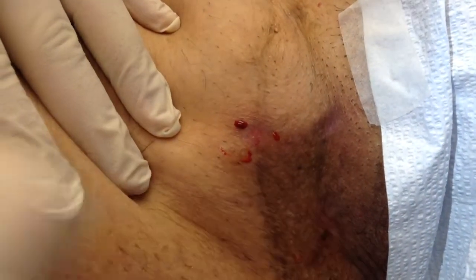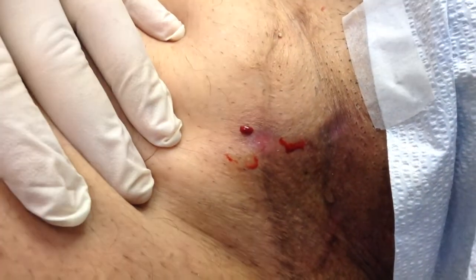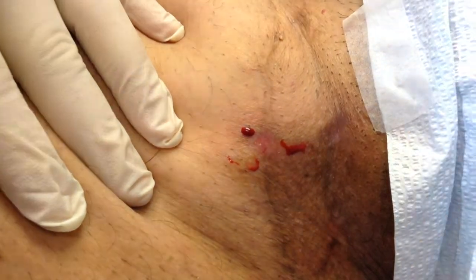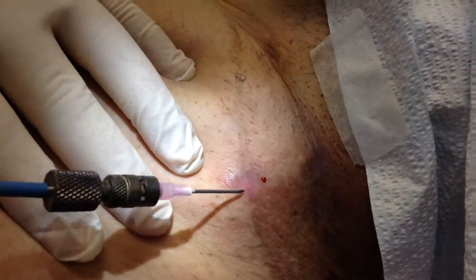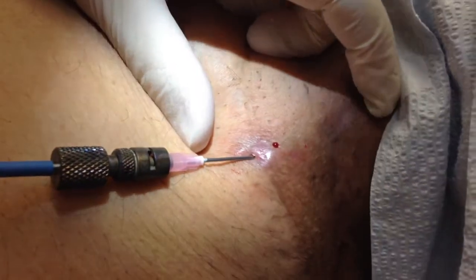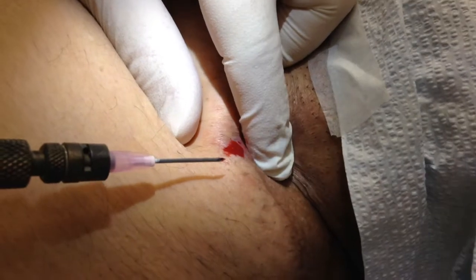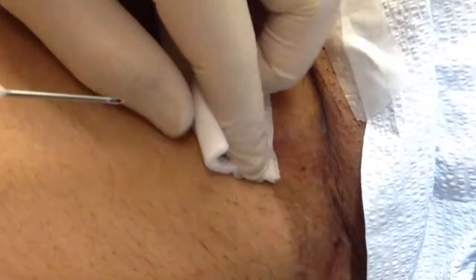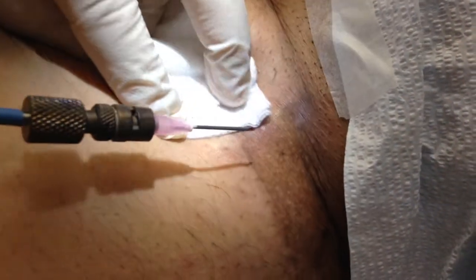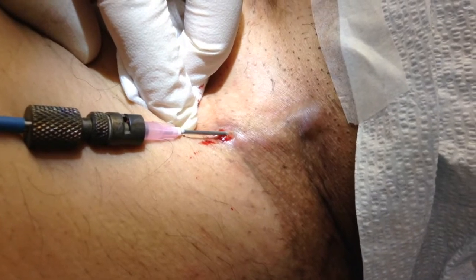The patient is being very quiet, but it does sting when I numb it up, and now it's going to be numb. It's a simple process. You can see the tissue fill up. You can see the tunnel right there.